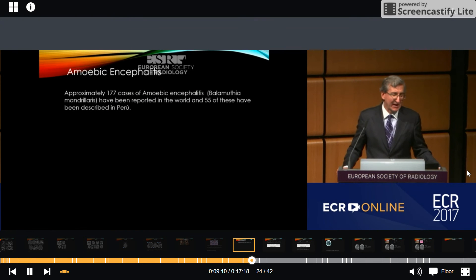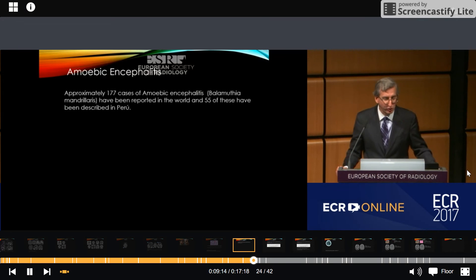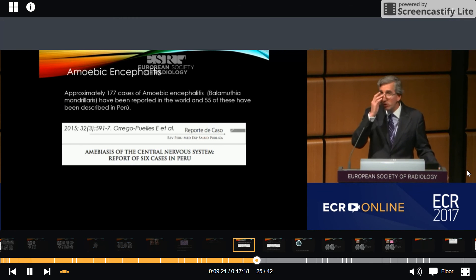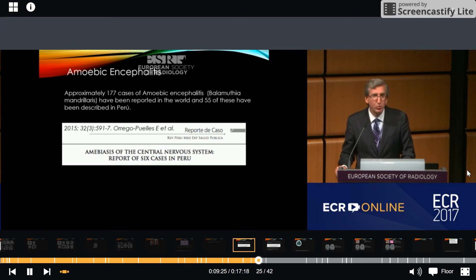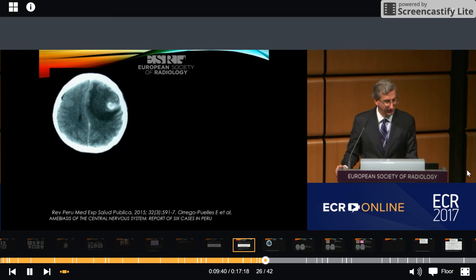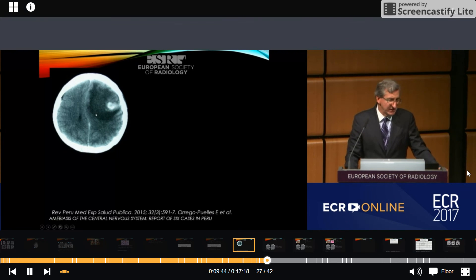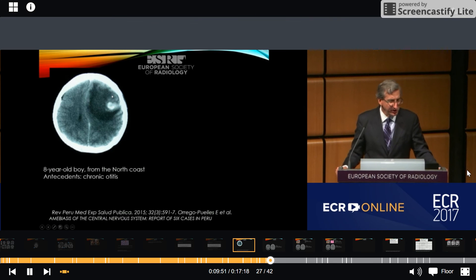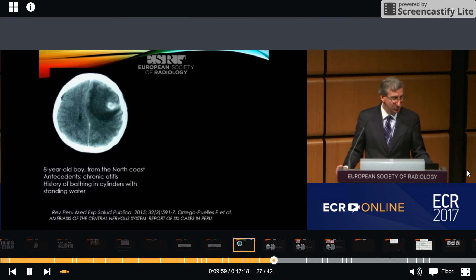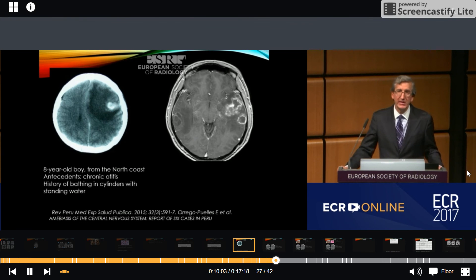There have been approximately 177 cases of amebic encephalitis reported in the world, and 55 of these have been described in Peru. I want to present this report of six cases admitted to the National Institute of Neoplastic Disease in Peru. They were admitted for clinical suspicion of malignant brain tumors and one orbital-nasal sarcoma. We can see here one of those cases — a focal enhancing mass with surrounding edema and significant mass effect in an eight-year-old boy from the north coast with a history of chronic otitis, who had bathed in cylinders with standing water.